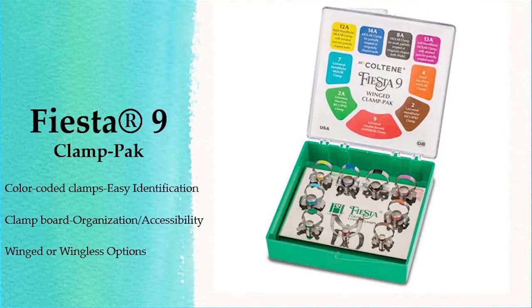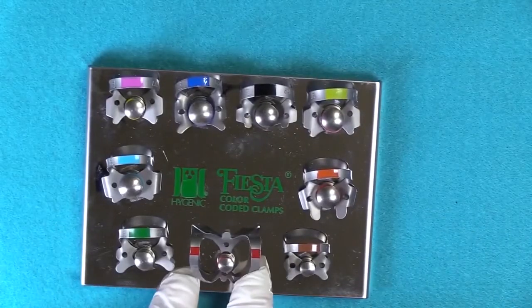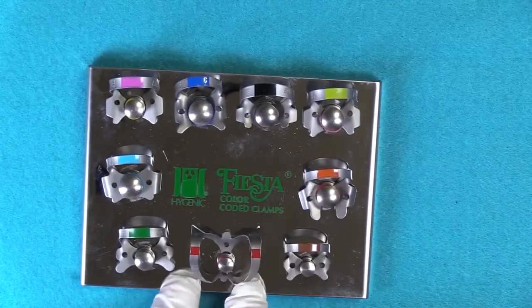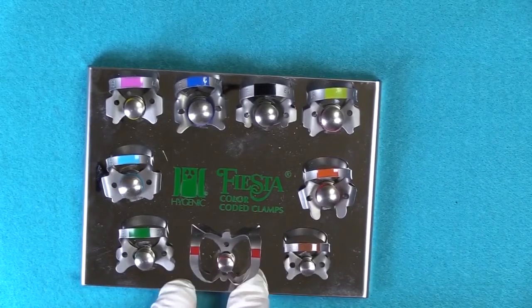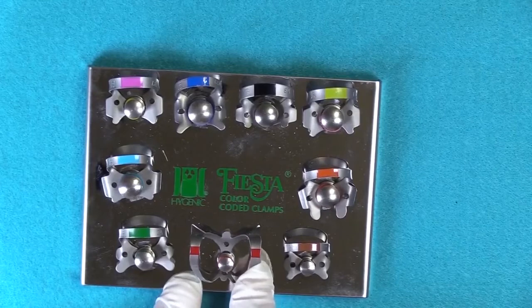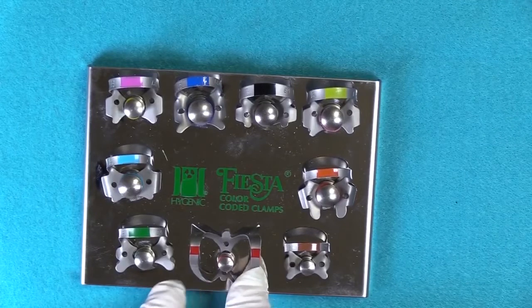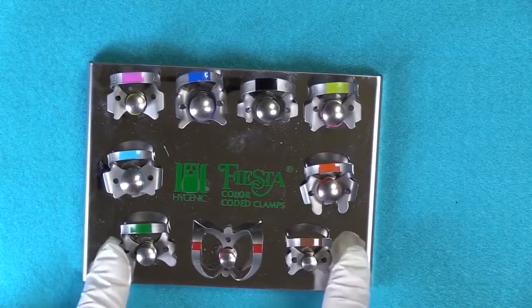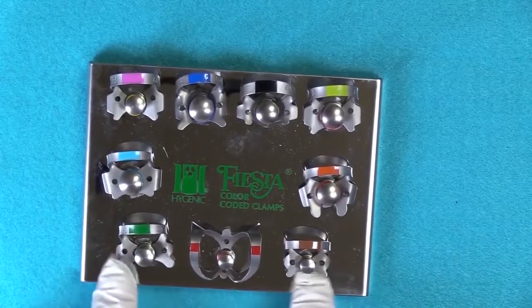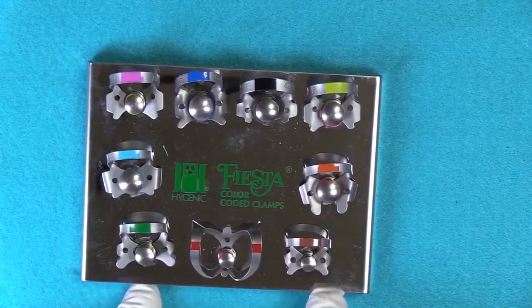Basically, what we've done is the anterior clamp is red coated. This number 9 is used for root canal therapy on the lateral centrals and canines, both upper or lower arch. The earth tones, the green and the brown, are the bicuspid clamps. Now, these are kind of universal. They can be used either upper or lower arch.